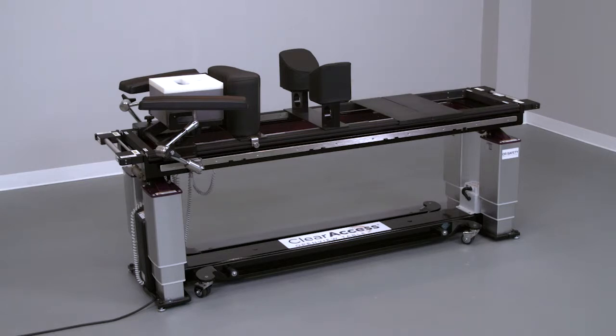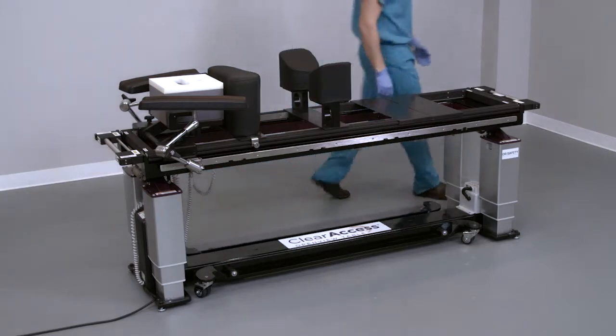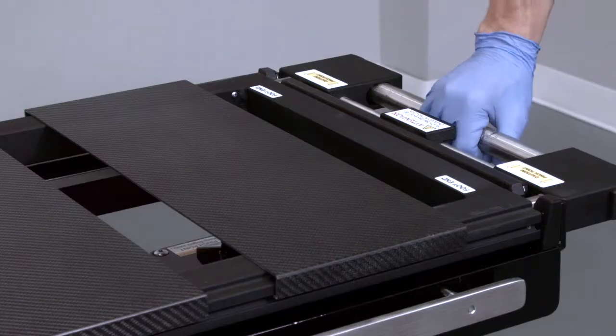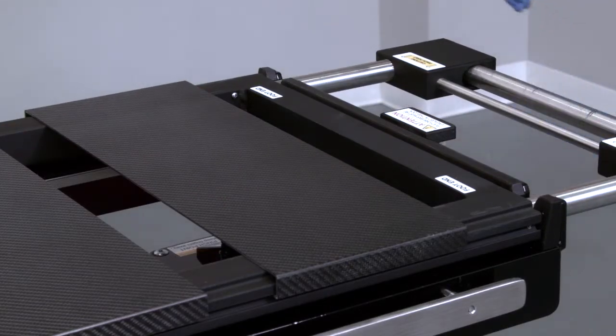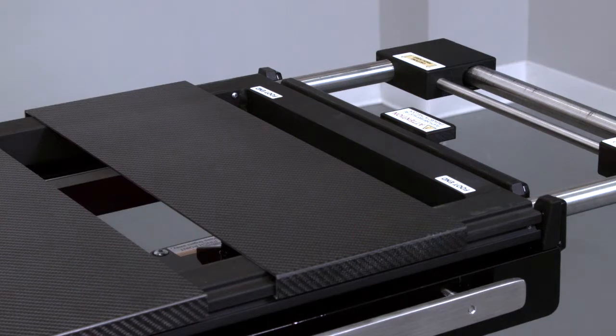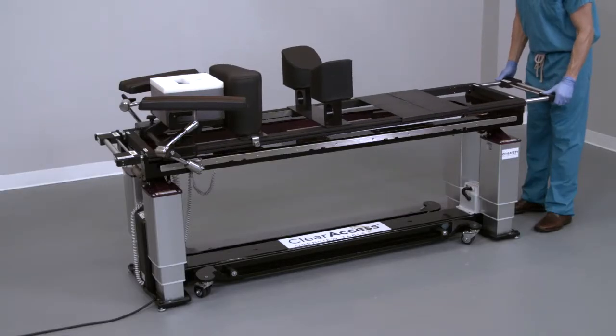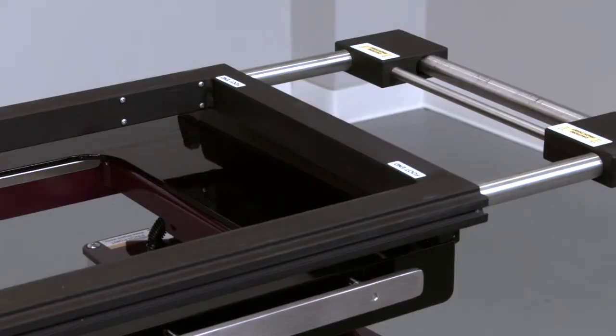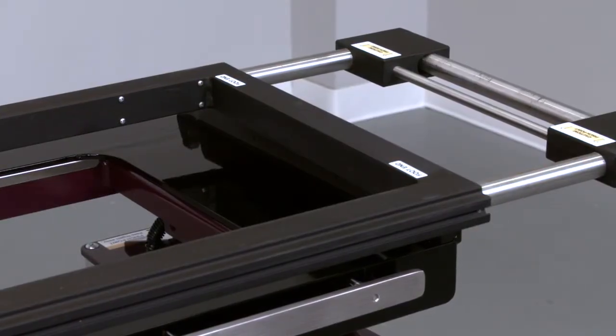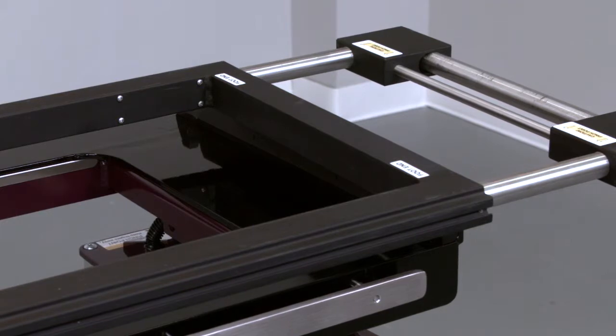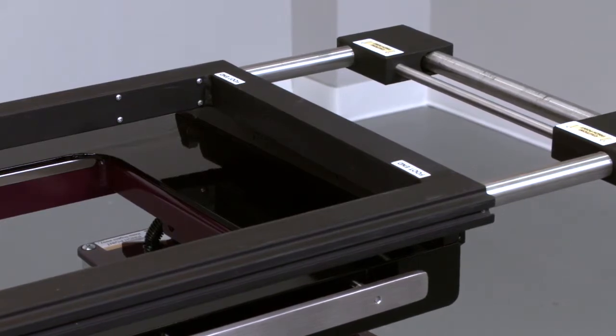First, remove both the thigh pad and the ankle rest from the carbon support pieces. Grasp the silver handle at the foot end of the prone platform and pull to extend the prone platform until it locks in place. Gently lift the foot end of the prone platform so that the platform is no longer engaged by the cradle of the ClearAccess table base. Then move the prone platform approximately two inches to the left or right and place it down gently so that the platform rests askew at the foot end only.